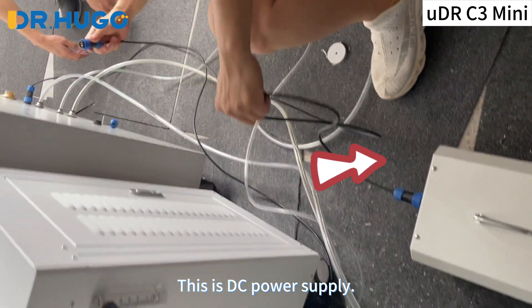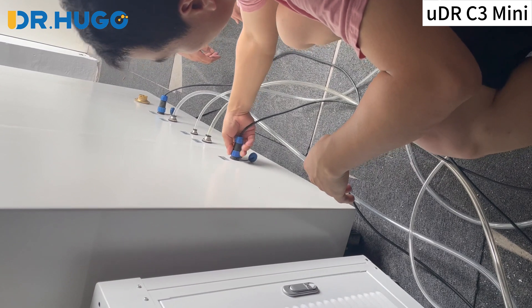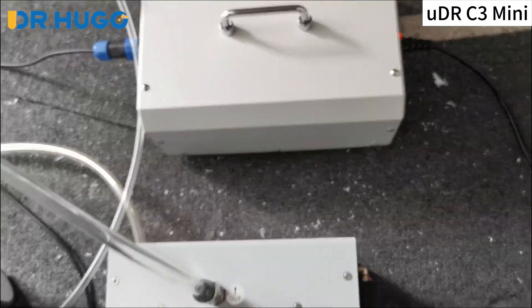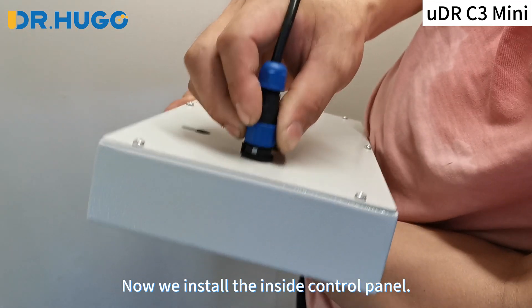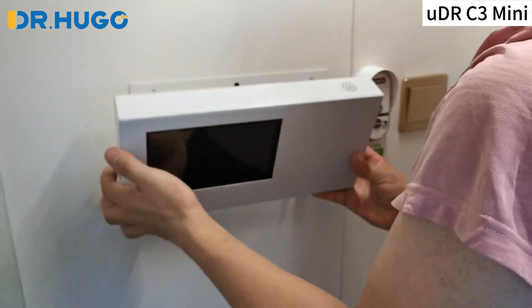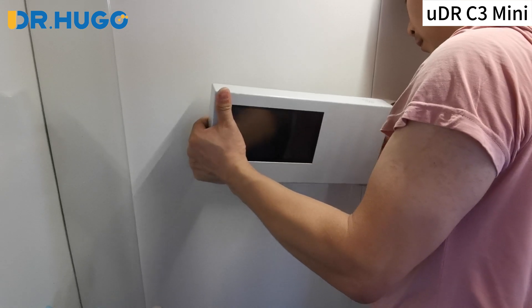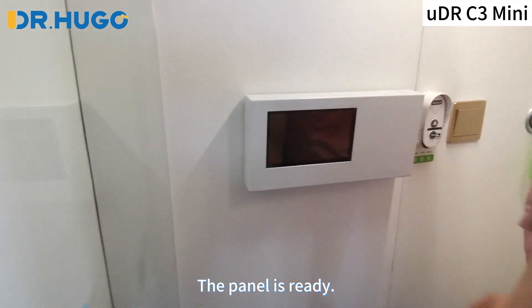This is the DC power supply. Connect the wire of the DC power supply. Now we install the inside control panel. The two holes are for hanging it on the board. The panel is ready.